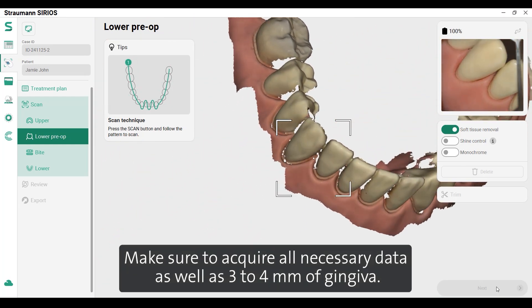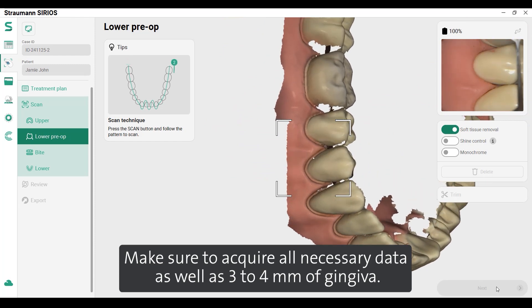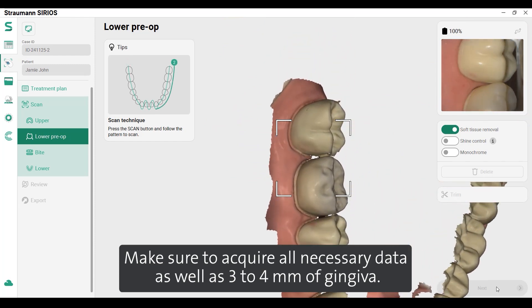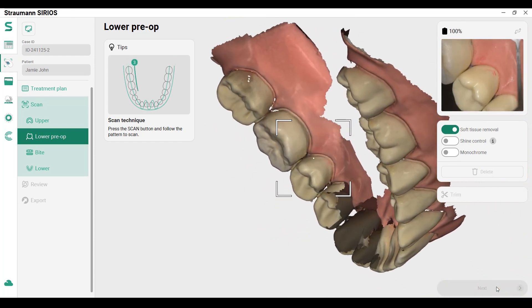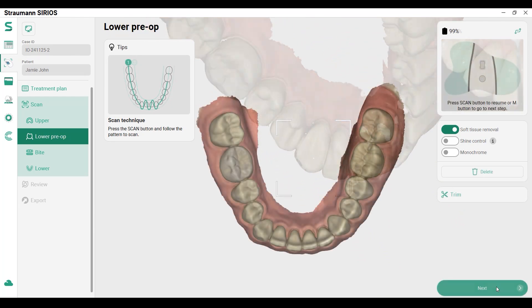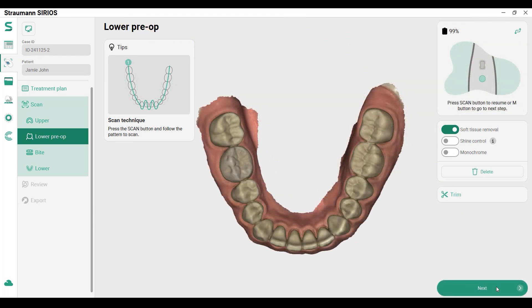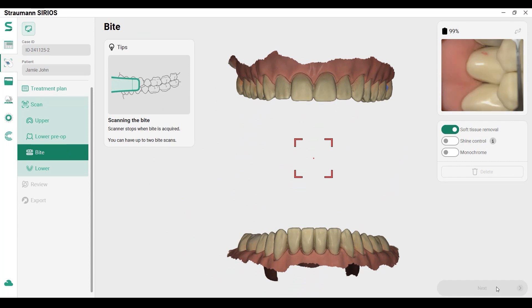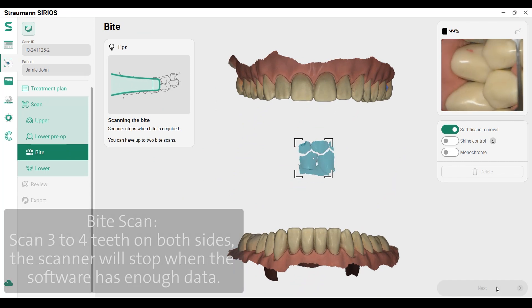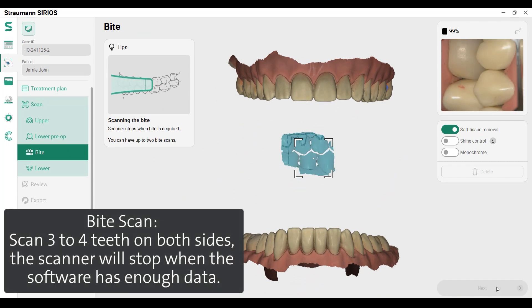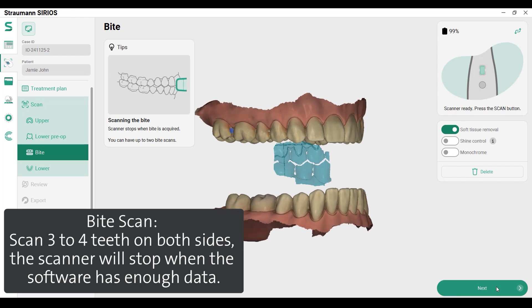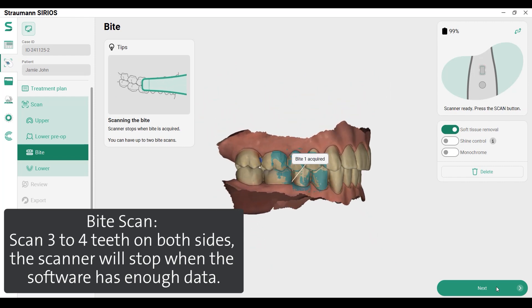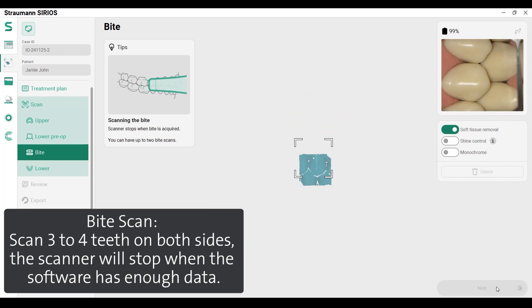In the pre-op tab, scan the teeth prior to prep. Make sure to acquire all necessary data as well as three to four millimeters of gingiva. For the bite scan, scan three to four teeth on both sides. The scanner will stop when the software has enough data.